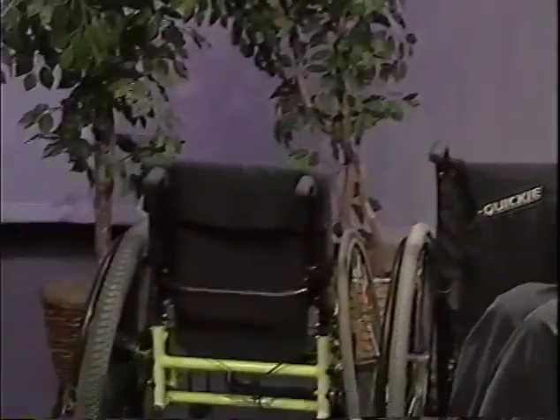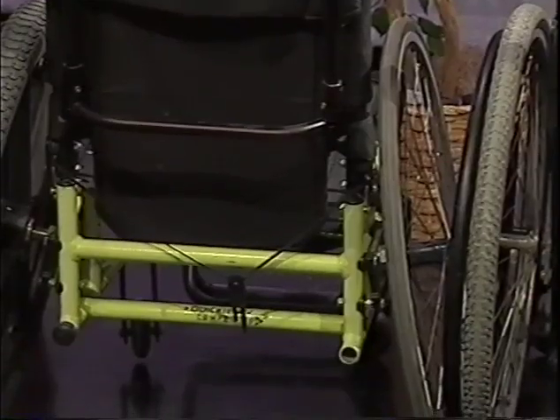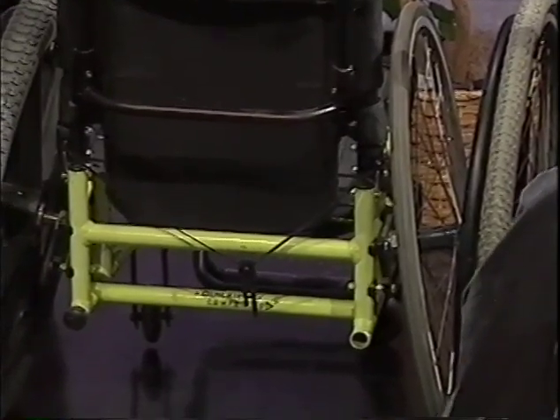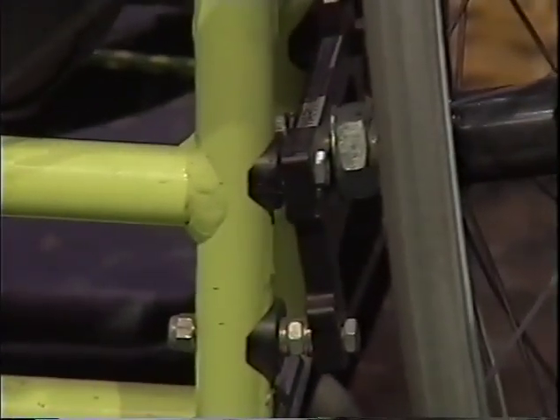And this chair over here, my tennis chair, you can see a fair amount of camber on it. It doesn't have the right tires on it right now because they're off on my bike. But if you look down in here where the axle plate mounts against the frame, you can see that there's spacers placed in there.